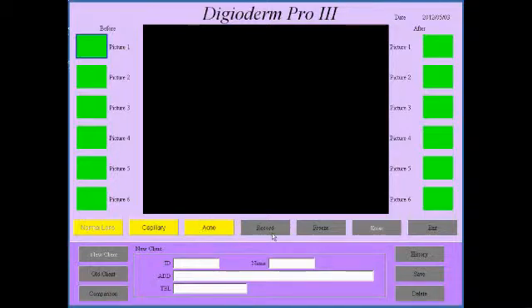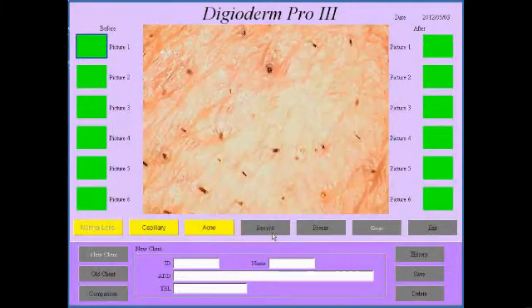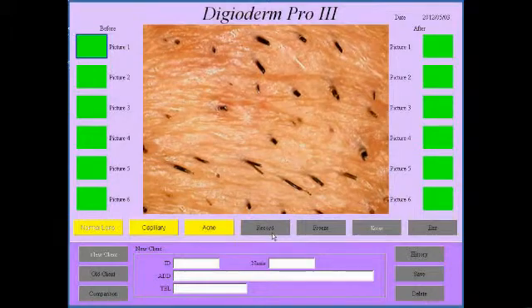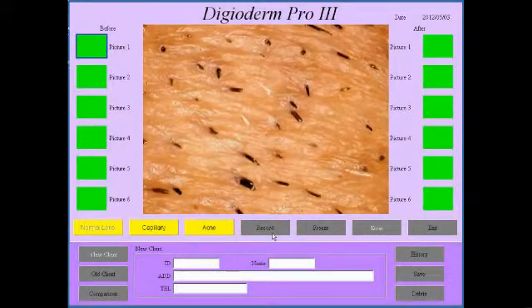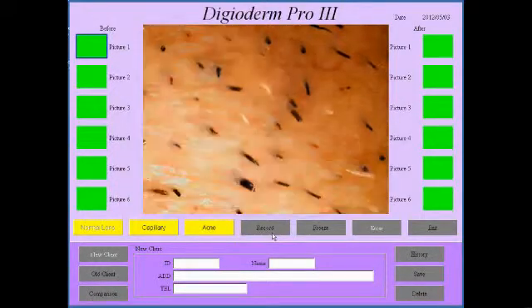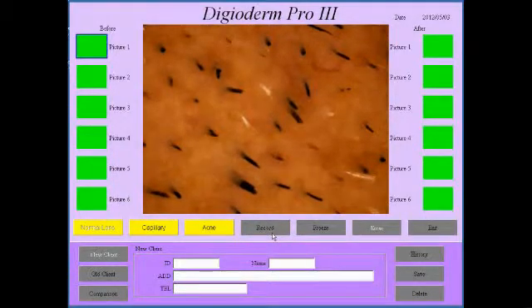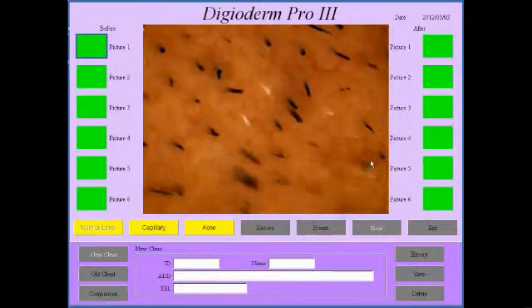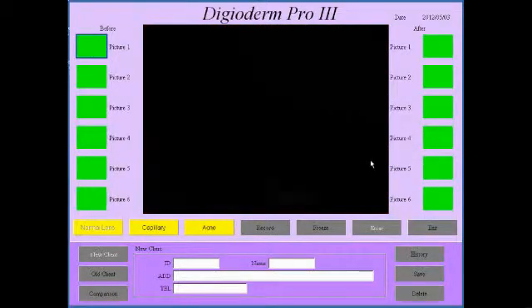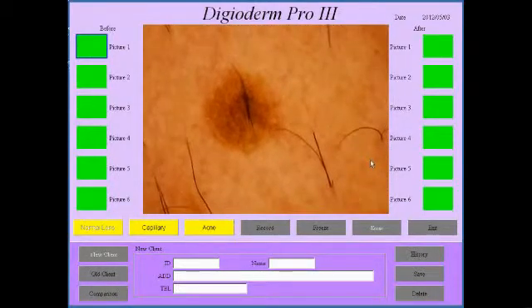You can also record video as well if you want. So what I'm going to do is just start off by showing you — moving over my stubble, you can see I haven't shaved since this morning. And to go to the polarized view I simply just click the dial, and you can immediately see the difference insofar as that it actually gives you the subcutaneous detail all of a sudden and you've got access to the capillaries. Now the same goes obviously for any moles or nevi — so put the spot on my stomach that I told you about, it's about a 2mm little spot.